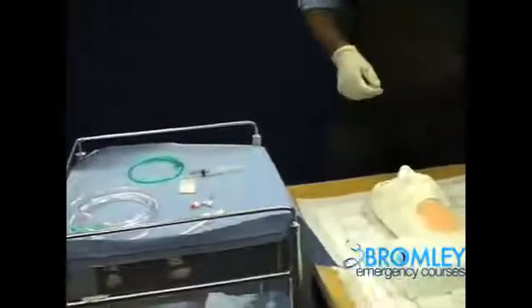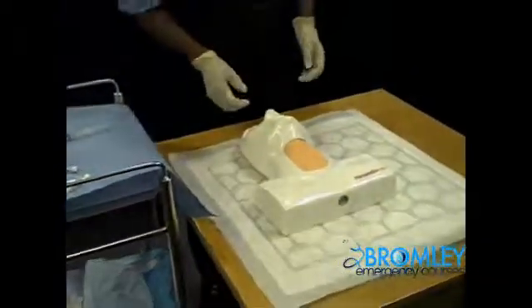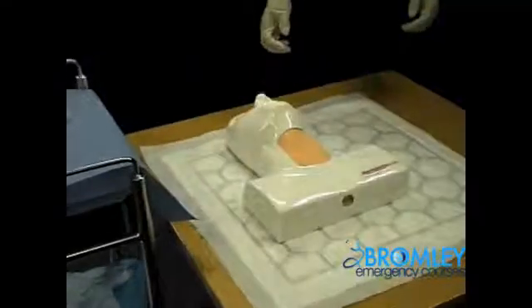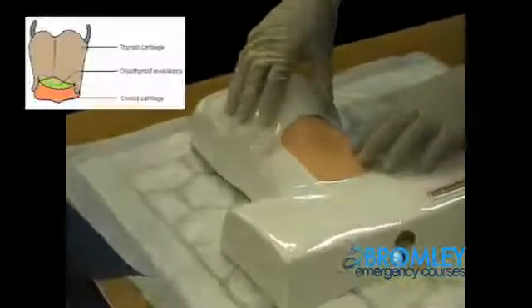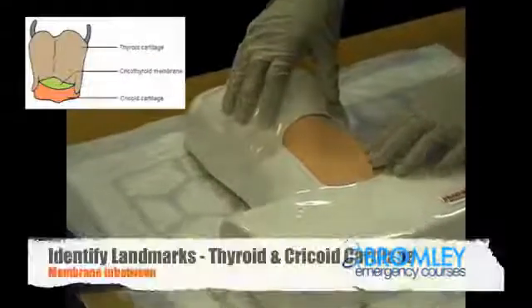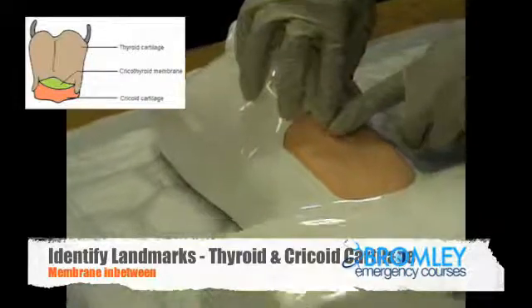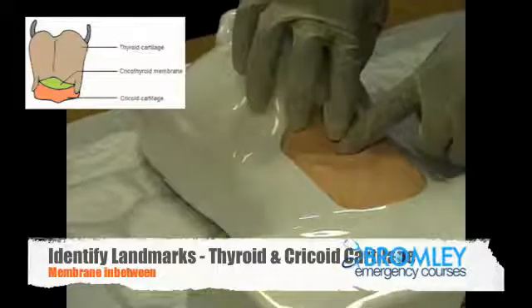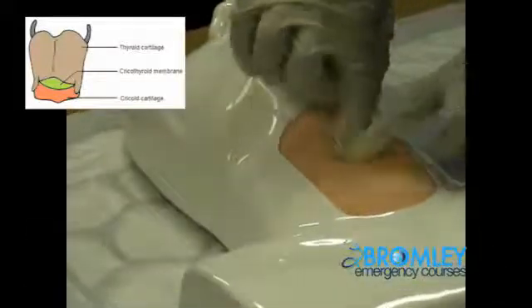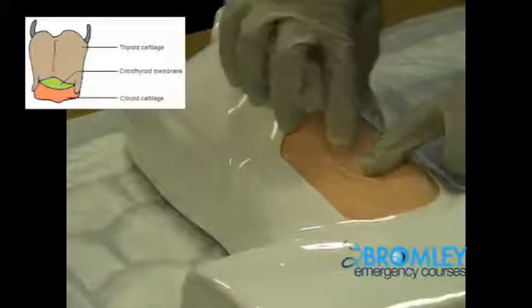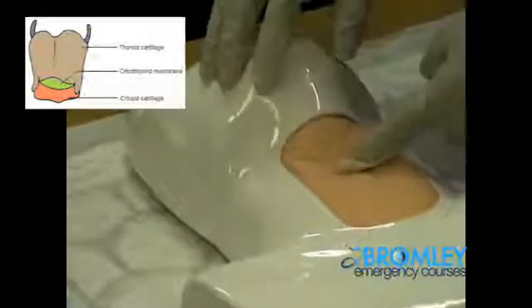This is a demonstration for needle cricothyroidotomy. First, locate the cricothyroid membrane by locating the thyroid cartilage, moving partway down, and identifying the junction between the cricoid and thyroid cartilage, which is the cricothyroid membrane.